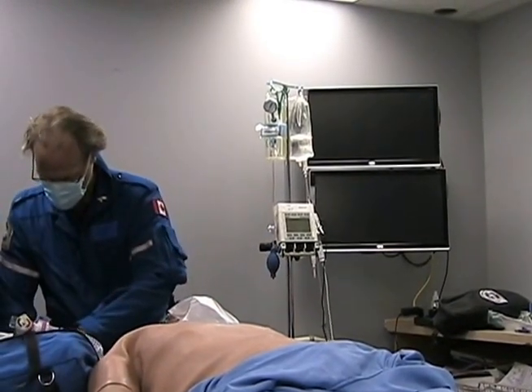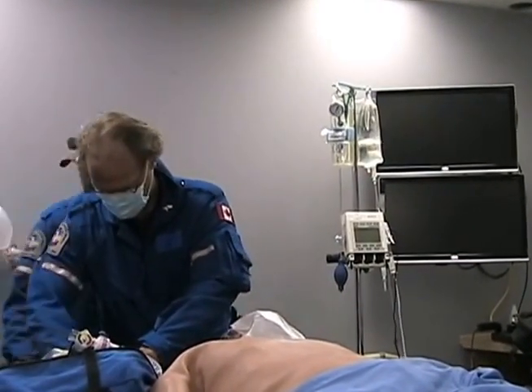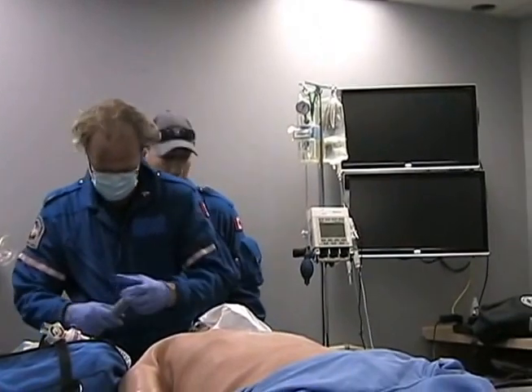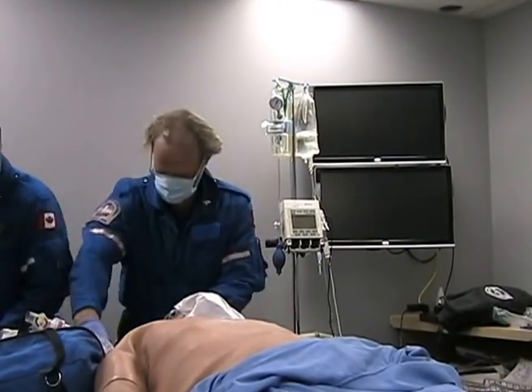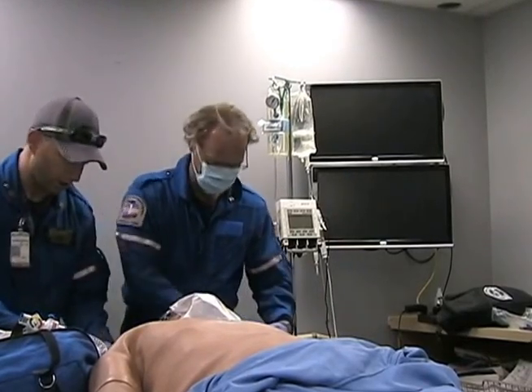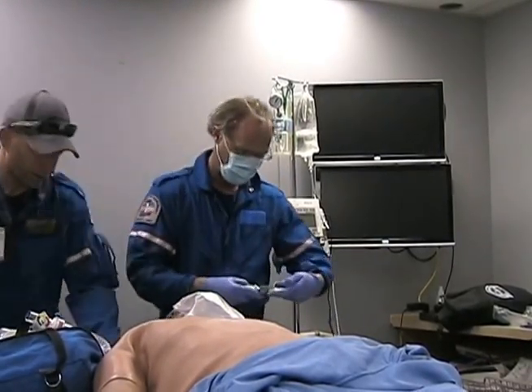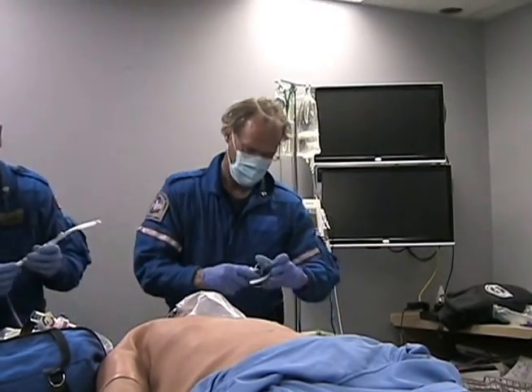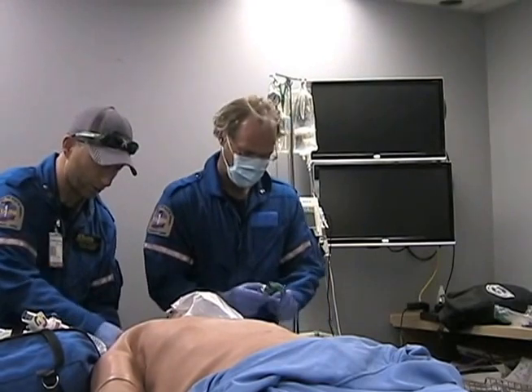Okay, Scott, so everything's ready to go. You've got a bagger, your circuit, the end tidal CO2 is warmed up, ready to go. Okay, can you test the suction then, please? I sure can. I've actually got it sitting right here. Oh, super. And then just turning it on. Yeah, just making sure it works. Yeah, it tests great. Okay, thank you. It's just underneath his shoulder.